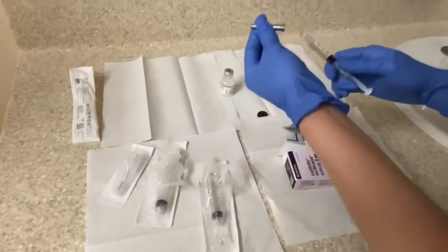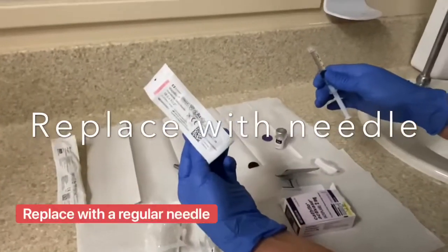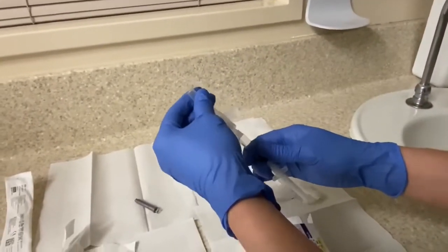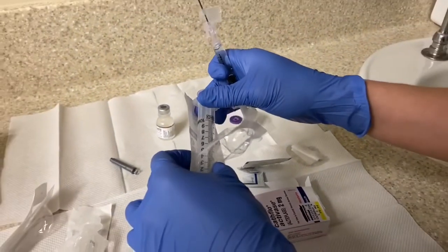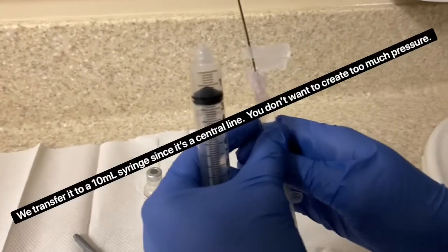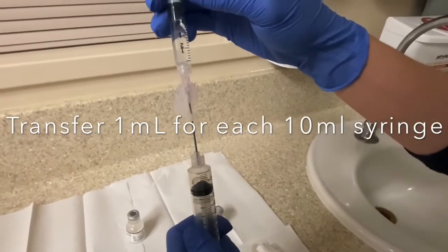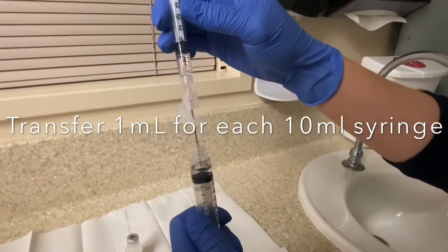Recap the blunt needle so it's easier to twist it off, then grab your regular needle — it's already prepped and open. Twist it on and be careful not to stab yourself; it's a pretty large gauge. Then take your 10 ml syringe and shimmy the plunger back and forth so it's not stuck. Carefully transfer 1 ml into each of the 10 ml syringes — and yes, that's 1 ml right there.